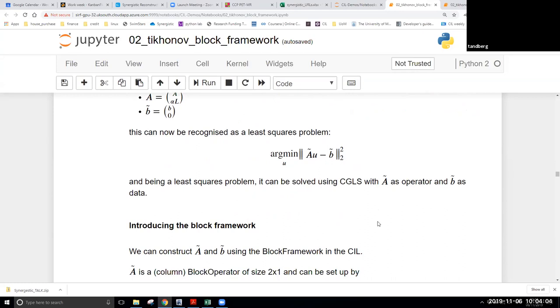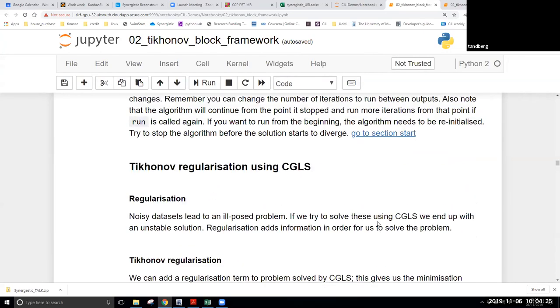And this is what the exercise guides you through, setting that up where the regularizing operator is the identity initially. And then, after that, you go to having the gradient as being the regularizing operator, which is again, actually a block operator. So, that's it, basically.